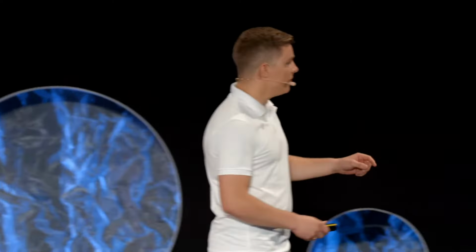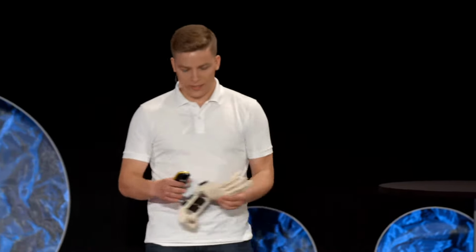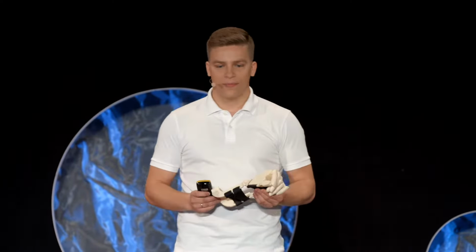Eva asked if we could 3D print her 6-year-old son a prosthetic hand. She had seen several examples online. They look much like this one. They have 3D printed fingers, 3D printed palm, and they work by using basic mechanics. For us, this task looked like a piece of cake.